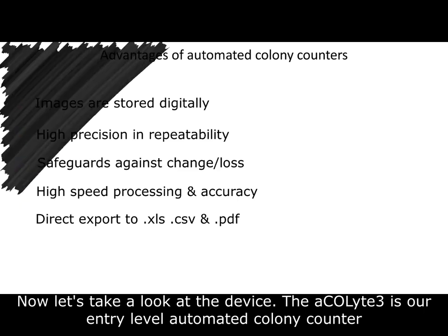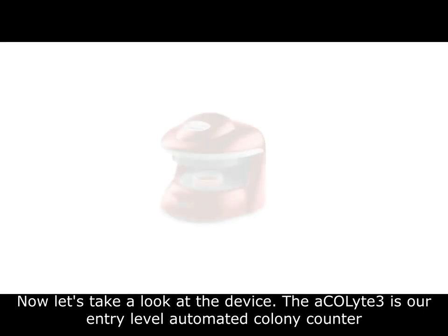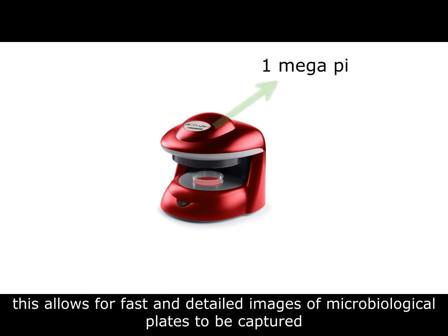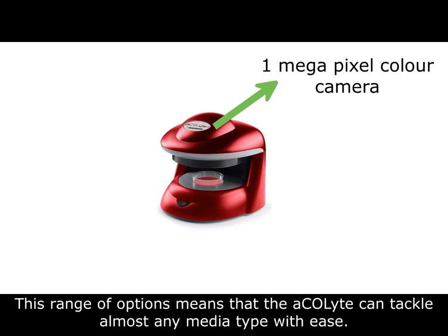Now let's take a look at the device. The aCOLyte 3 is our entry-level automated colony counter. It features a high-resolution 1 megapixel colour camera. This allows for fast and detailed images of microbiological plates to be captured. It has multiple lighting modes that can be cycled and also 2 contrast plates. This range of options means the aCOLyte can tackle almost any media type with ease.